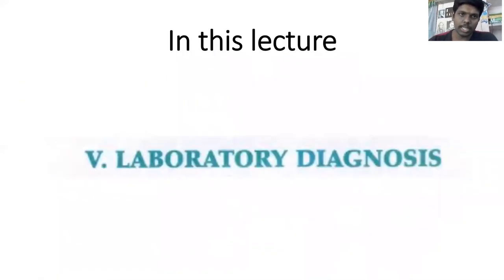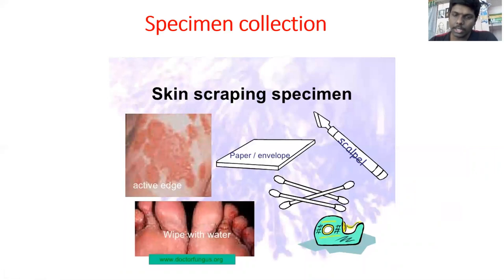Then coming to today's lecture. In this lecture, we are going to discuss laboratory diagnosis. Let us see how fungus is diagnosed in the clinical laboratory. First, we need to collect the sample. The fungal sample can be collected from nails, hair, skin, even biopsies.